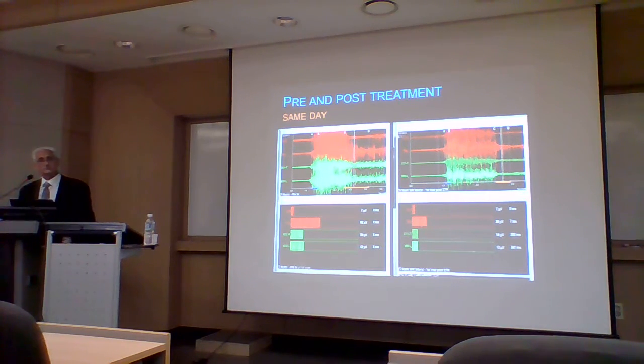그래서 우리가 지금 오프에 볼 T스캔이나 EMG 같은 걸 사용하게 되면 이전에 우리가 그냥 결과로서 개념적으로 가지고 있던 거와 다른 목표들을 가지면서 교합에 관련된 프랙티스를 할 수 있을 거다라고 주장하신 거예요.